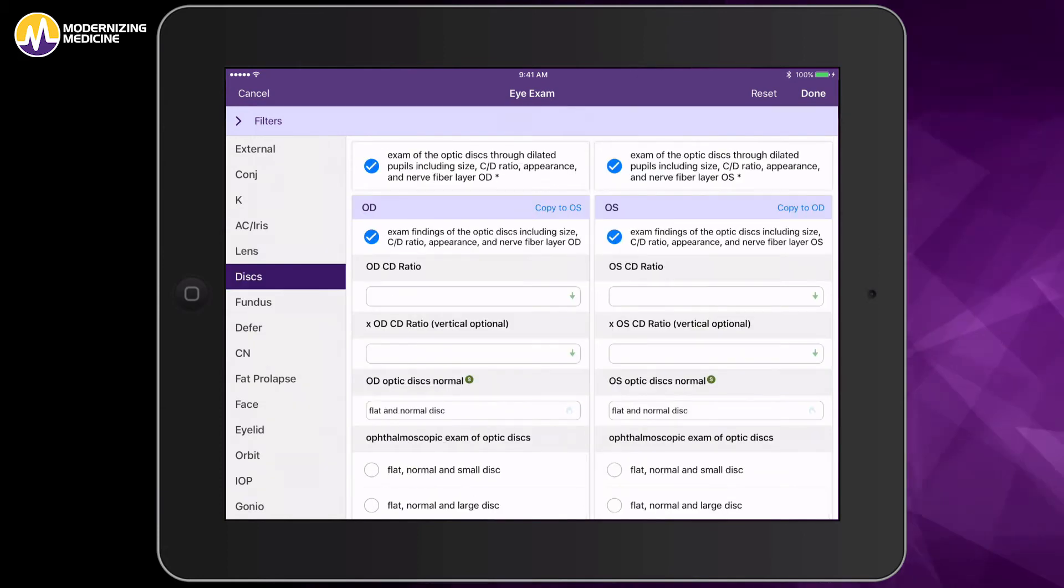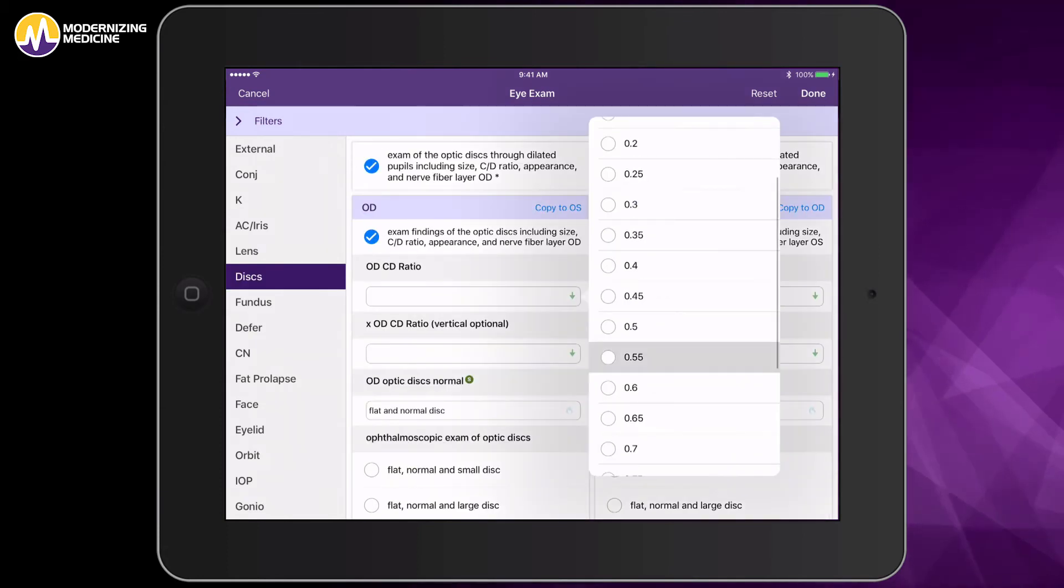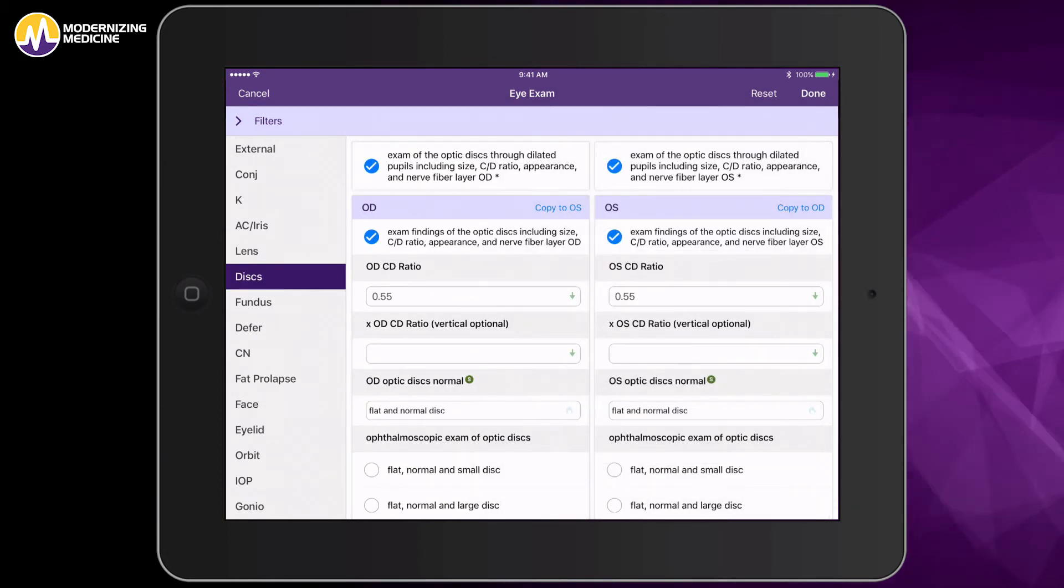We'll go to the discs, put in 0.55 in the right, copy it to the left with one touch, and we're finished.